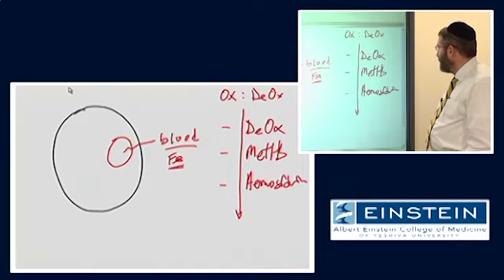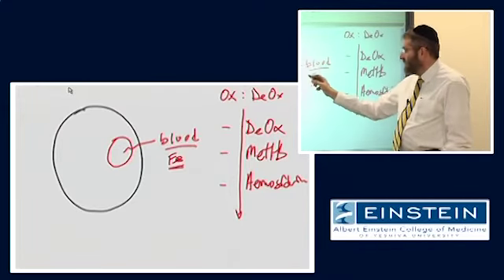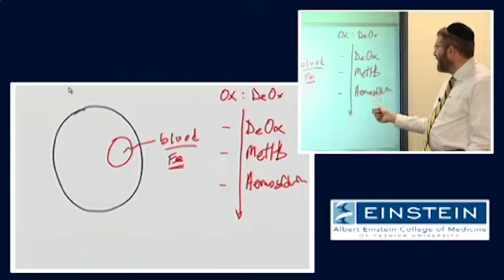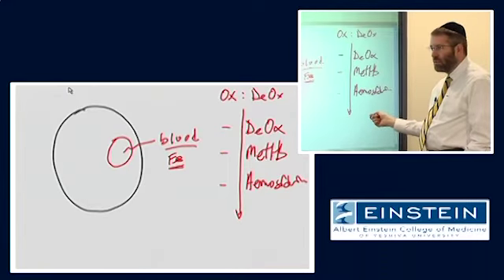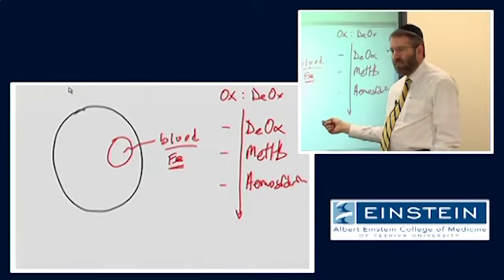So, for example, iron is paramagnetic. There's always iron in all of these cases. However, we're not always going to see a magnetic susceptibility effect.